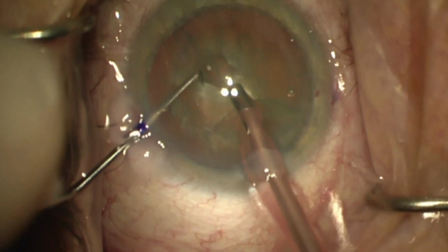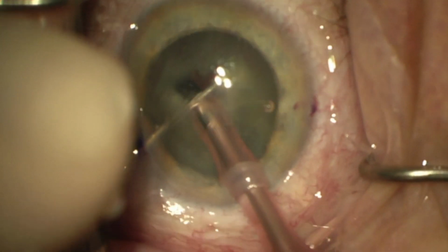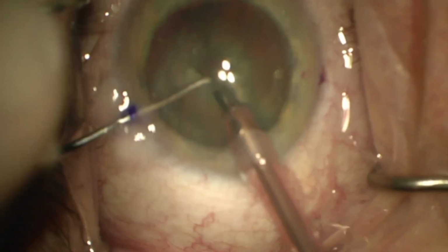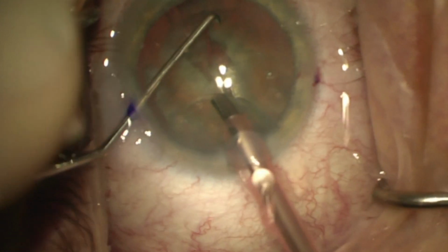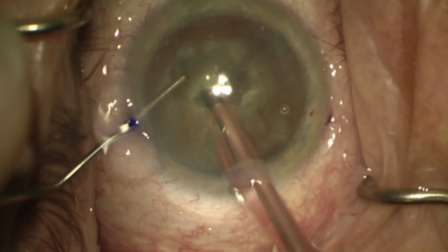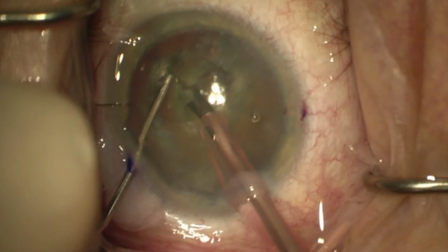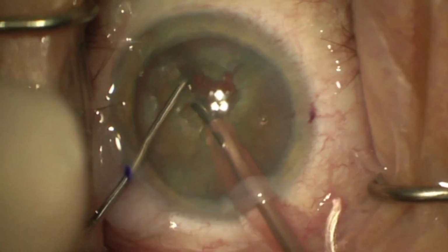I like to sometimes rotate 180, just to make sure that I can accentuate that crack and make sure I got a full thickness crack, as here. The next step is just to keep repeating it. Again, note that the force is actually 80% down, 20% up, and then separation.